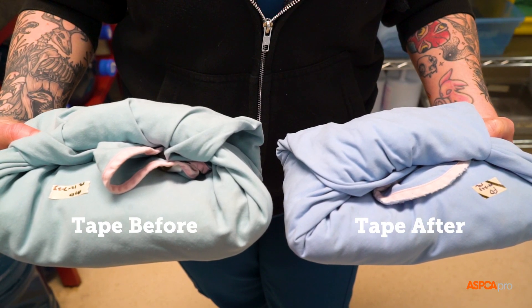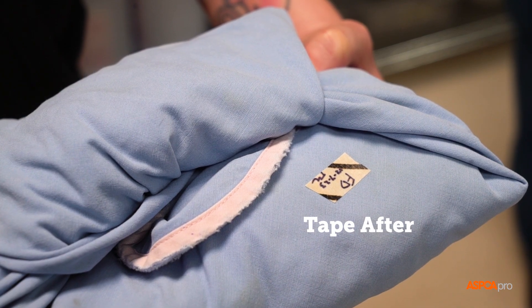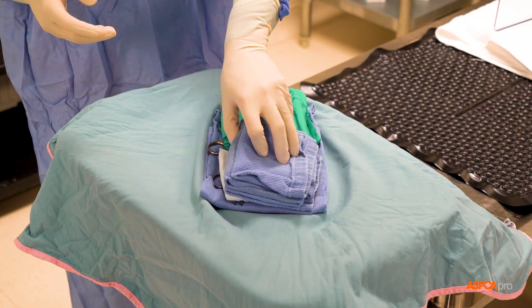The autoclave indicator tape will change color, showing that the pack has been through the autoclave and can be stocked for use. It does not, however, confirm sterility.